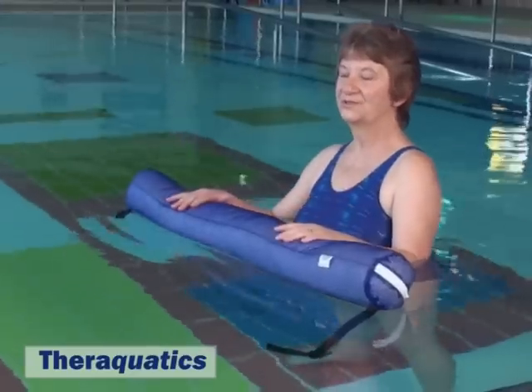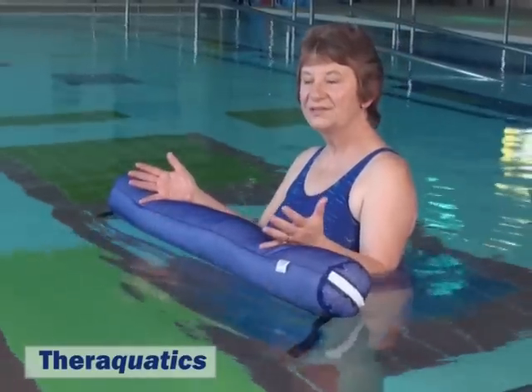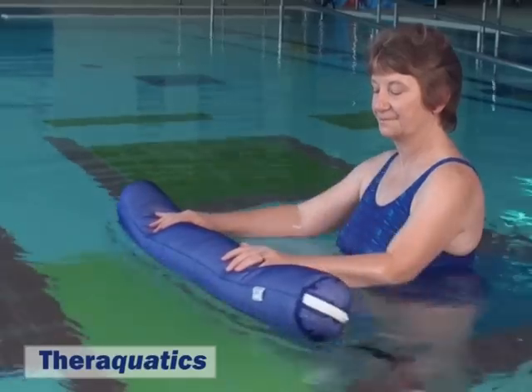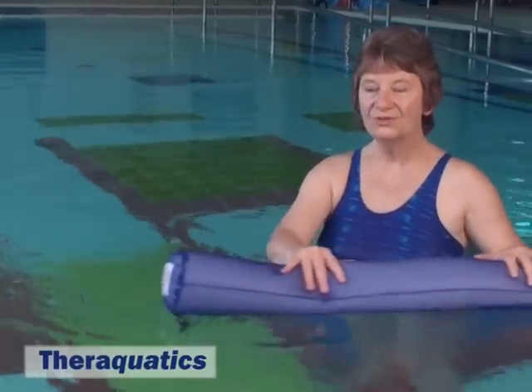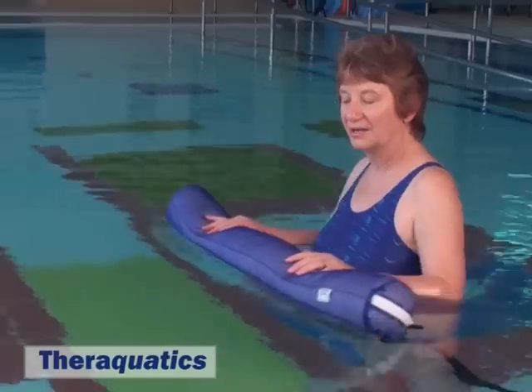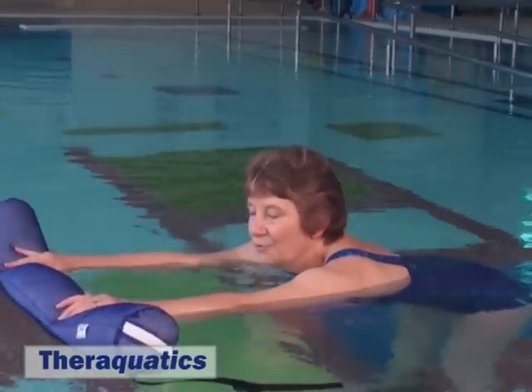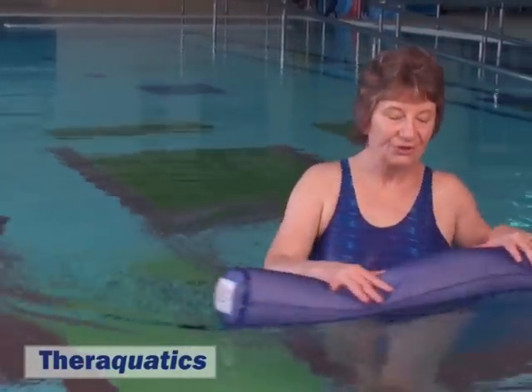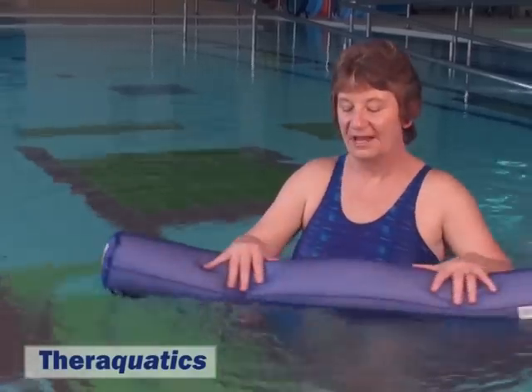Other uses of the sausage float include in the standing position where arm exercises may be done. Also activities to exercise and stretch the trunk, such as leaning forwards, arching back, turning, and many other variations.